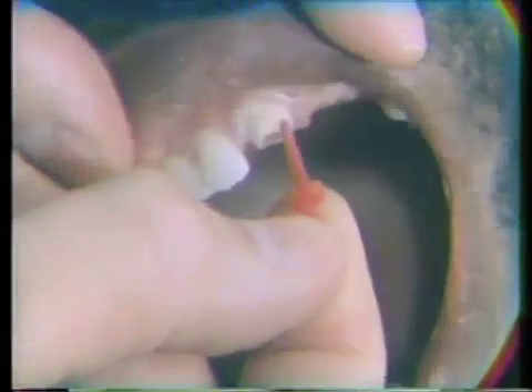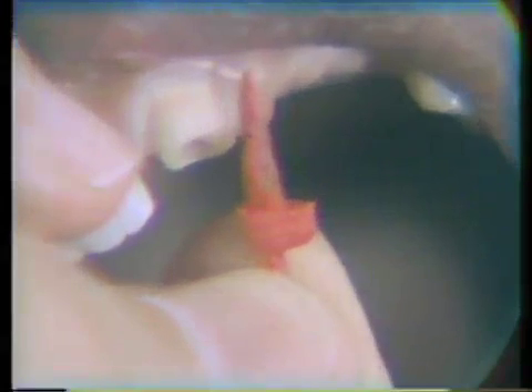The Duralay has now been trimmed with a sand disk so it has the proper contour from the labial, mesial, distal, and lingual. When we take this out you'll be able to see the anti-rotational notch that we've placed in the pattern itself. Now the Duralay post will be placed on a sprue former and will be cast.